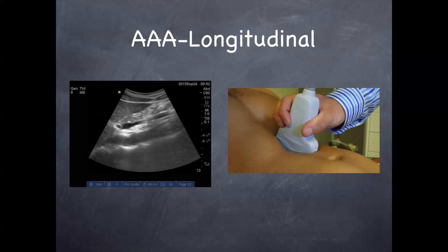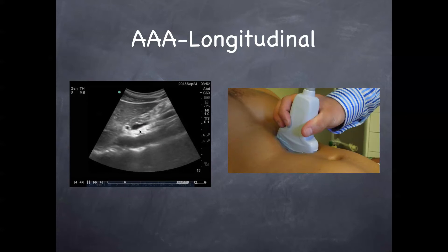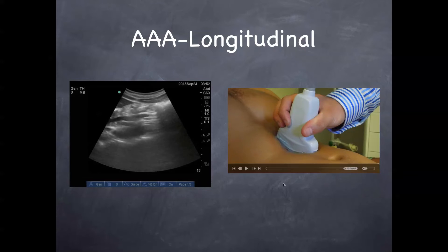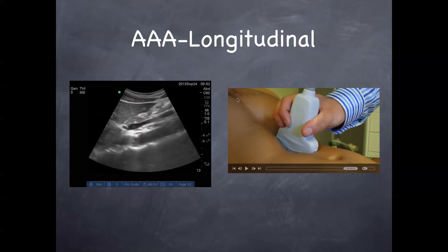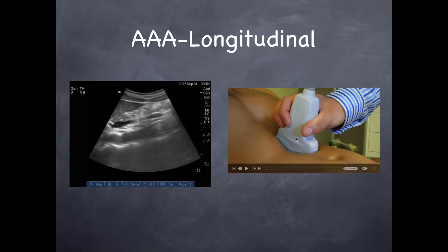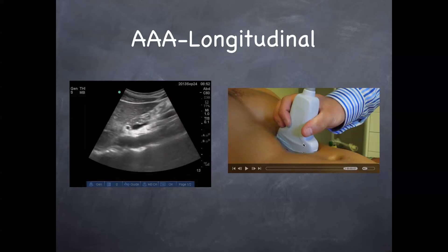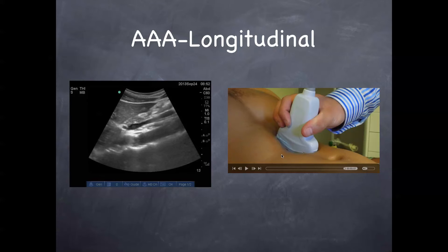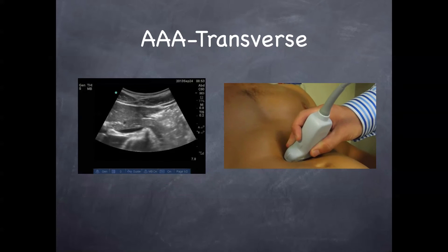This is a longitudinal view. The big teaching point here is to make sure you're not getting the IVC. If you think of the anatomy, the IVC would generally be more on the right side of the patient, returning blood to the right atrium, whereas the aorta is going to be more on the left side of the patient, giving blood down to the body. When you get this longitudinal view, make sure you're not getting the IVC. You can do that by moving your probe back and forth on the belly, as well as confirming with a transverse view.